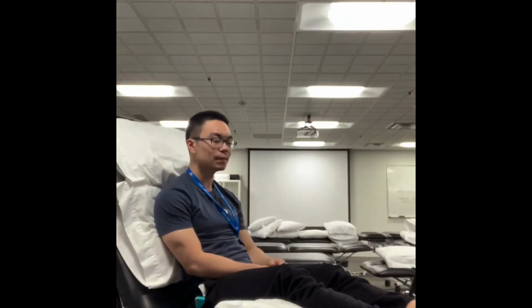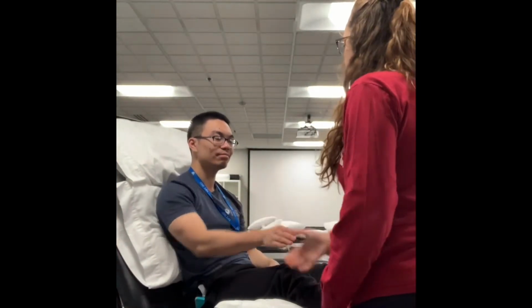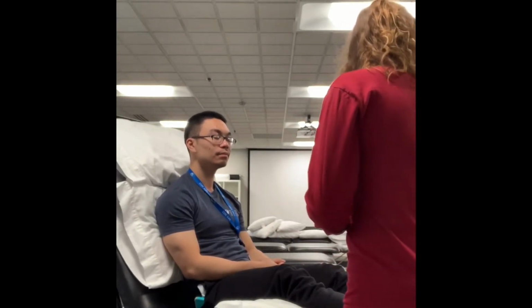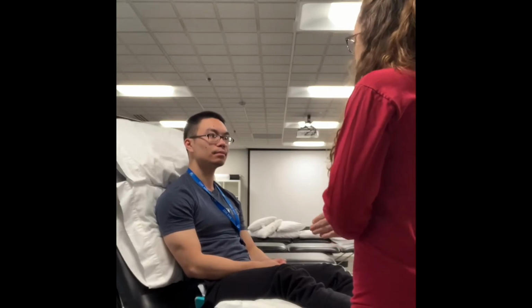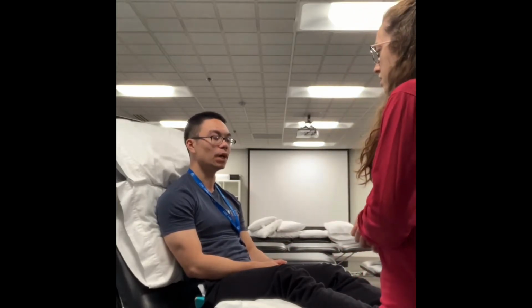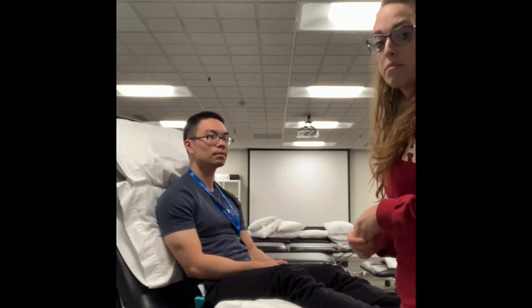So let's meet John. Hi John, my name's Emily. I'm going to be your student physical therapist today under the observation of Dr. Clausen. So we're going to use ultrasound today, if that's okay with you. Have you used ultrasound before? No. No? Okay, so I'll tell you a little bit about it.